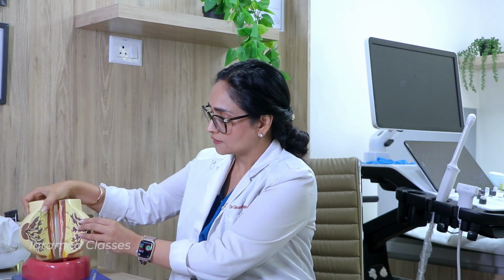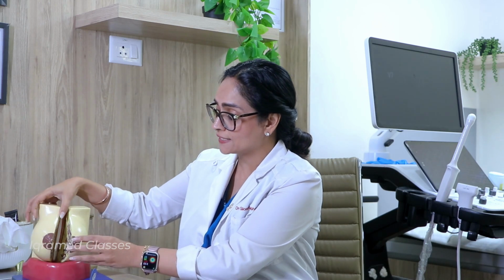If you find something, you make a note of it. Always tell your patients to do the self-breast examination after they go from your clinic, because then they would know how the normal breast feels, or if there is a cyst, how it feels, if there is a fibroadenoma, how it feels.